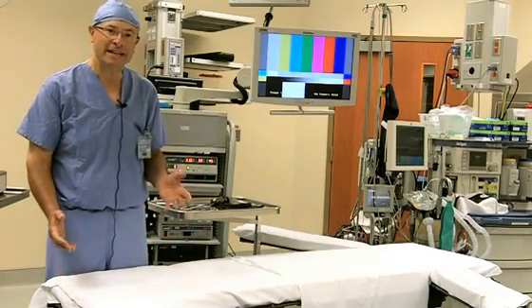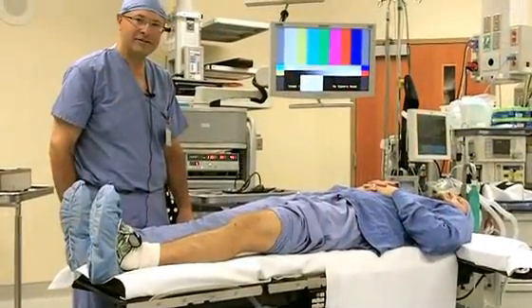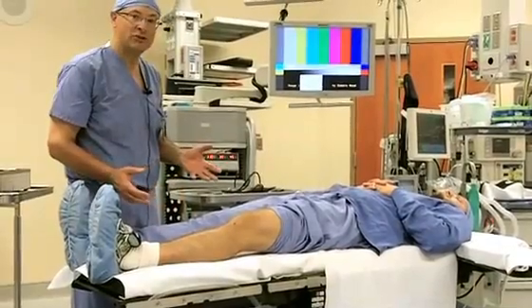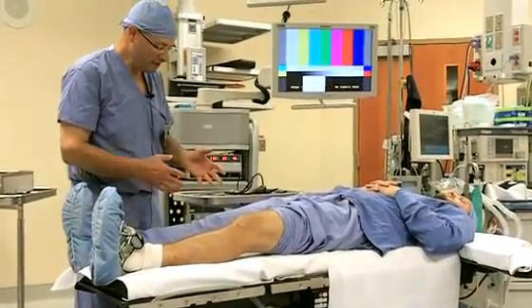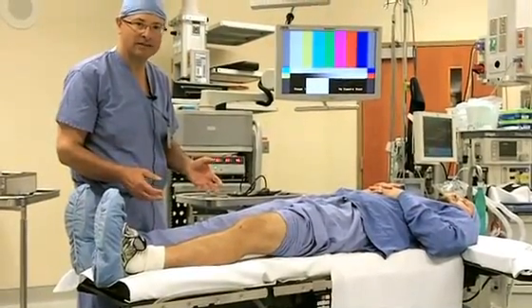Today we're going to talk about knee arthroscopy, specifically meniscus tears. This is Dan. He's volunteered to be our pretend patient today. Later on we will show a video of an actual patient who had knee arthroscopy, but this is just some preliminary views to show you some of the instruments and how knee arthroscopy is done.